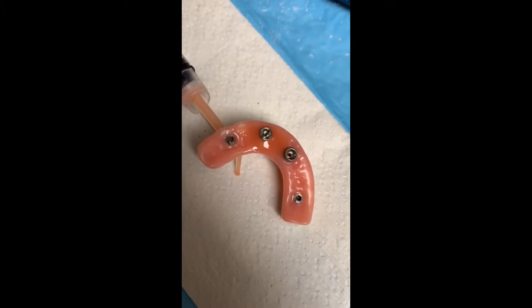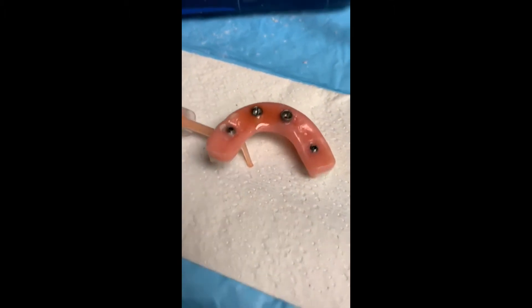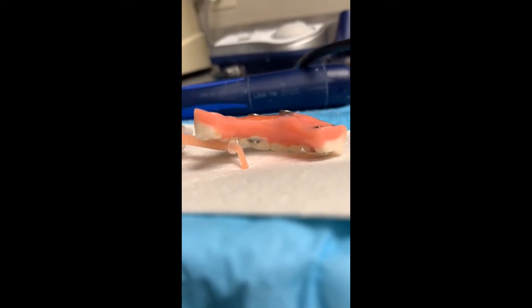So this is almost done. I'm going to let that cure for two minutes, put it in some hot water for about five minutes. And then I have very little temporary cylinder to remove on the occlusal surface.